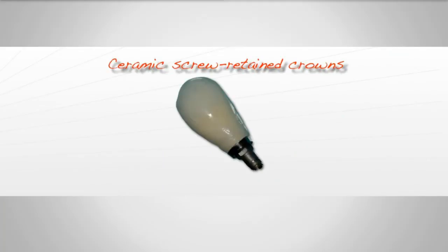Now, why am I reverting back to screw-retained crowns and restorations? There are several good reasons. One, you still have the aesthetics of a ceramic restoration, where in the old days, when we first started doing this, we were doing it with metal ceramic crowns. And which type of Emax am I using? I'm using the Emax Press, but the Emax CAD is fine too.